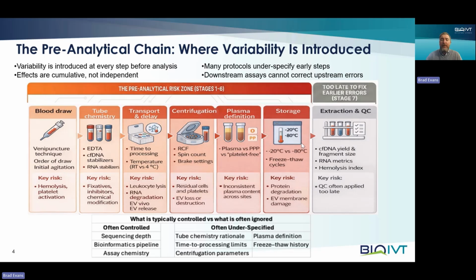It starts with the blood draw itself. Venipuncture technique, order of draw, and how the tube is initially mixed all matter. Poor technique can cause hemolysis or platelet activation, and that immediately changes the molecular content of the sample before it even leaves the clinic room.